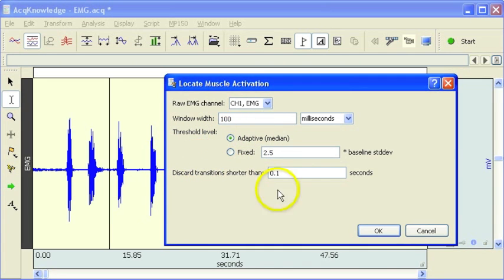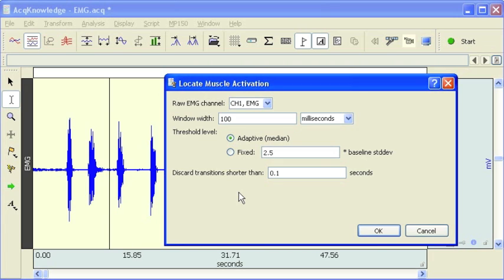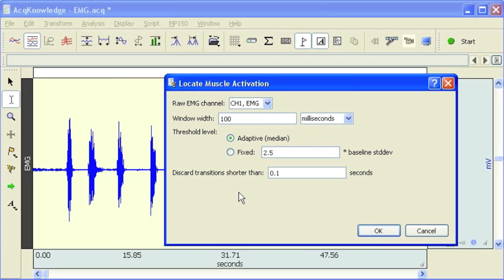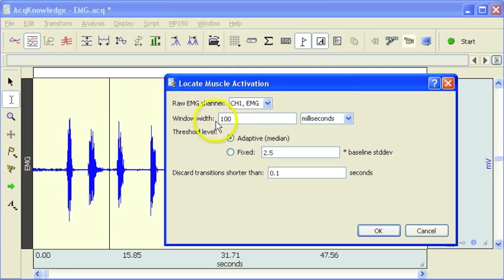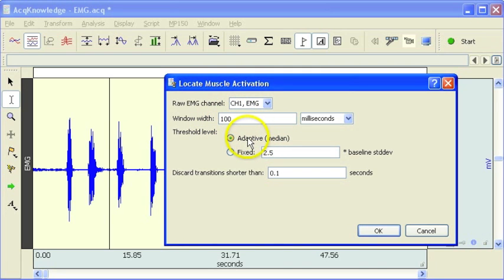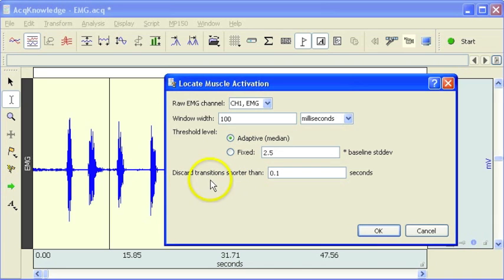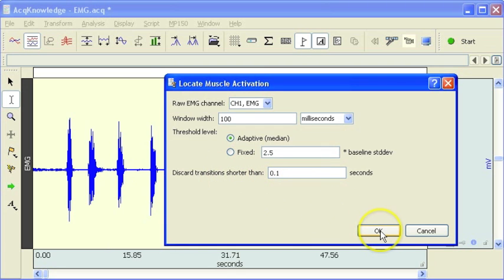And then in order for this to work well, you need to have a reasonably good resting period or a good return to baseline before another muscle activity or further muscle activity occurs. So anyway, let's just leave this the way we've got it set up. So channel 1, we've got an integrated window width of 100 milliseconds, we're going to use the default adaptive method, and then we're going to use the discard transition shorter than 100 milliseconds option.